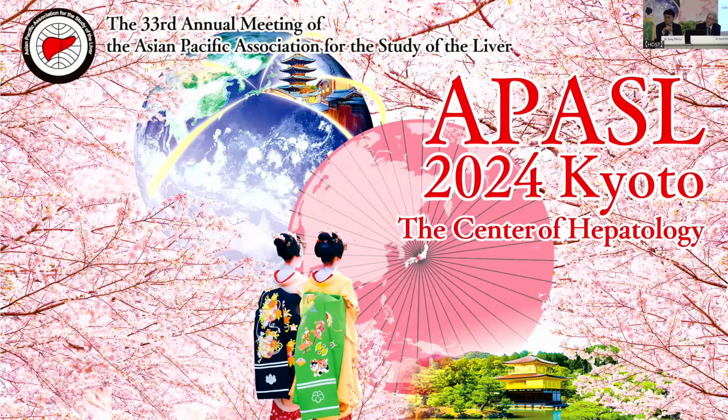I have one question for you. In clinical practice, from time to time we use artificial ascites in order to avoid side effects, unnecessary thermal injury to adjacent structures. When we use that, the liver deforms compared to what it originally was.